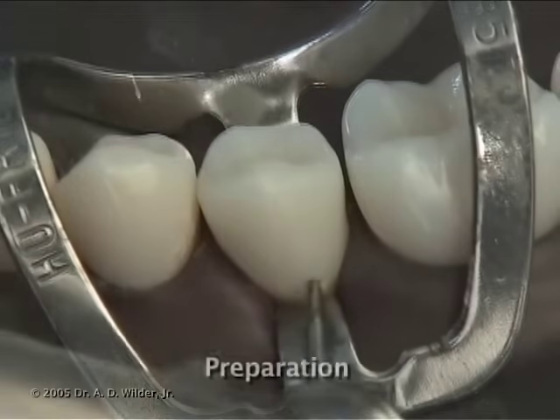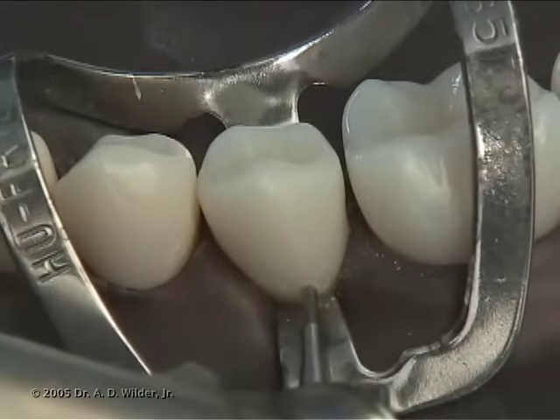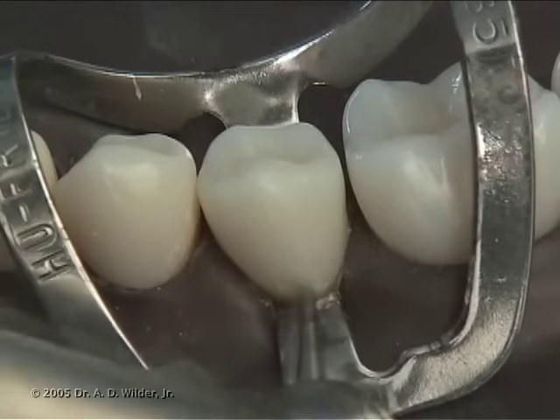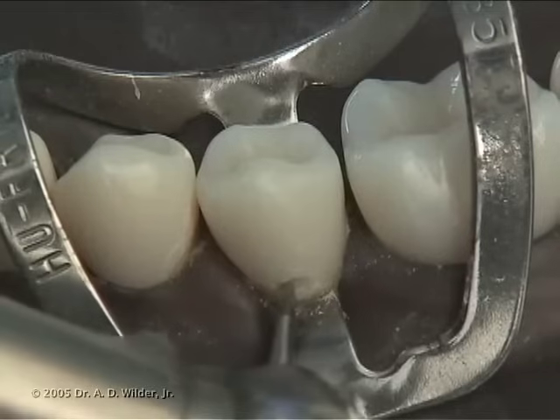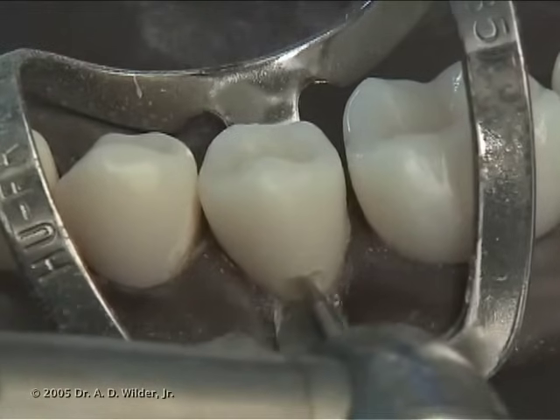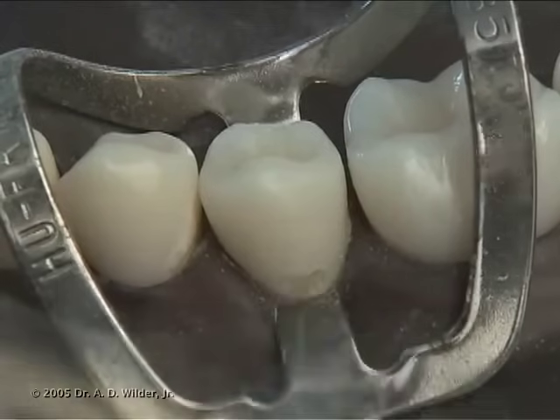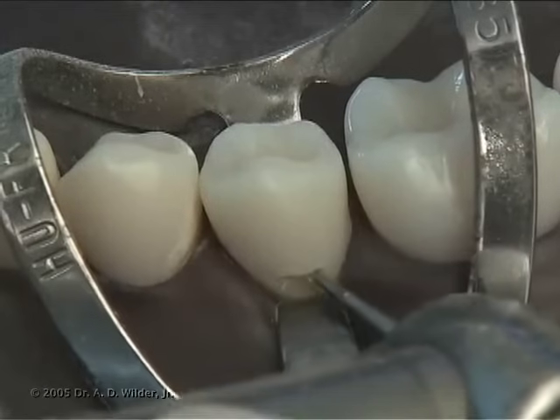With a 271 tapered fissure burr, or round burr if you prefer, create a crescent or semi-circle shaped preparation following the gingival contour. Extend mesial and distal to include the extent of decay or the non-carious cervical defect. Prepare to a uniform axial depth following the convexity of the surface you're working on, in this case the facial surface.